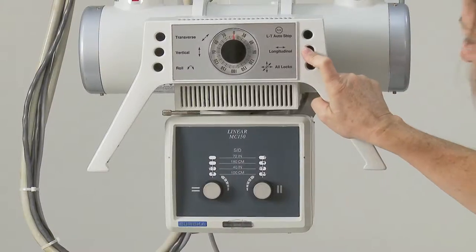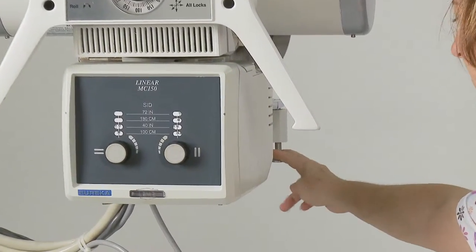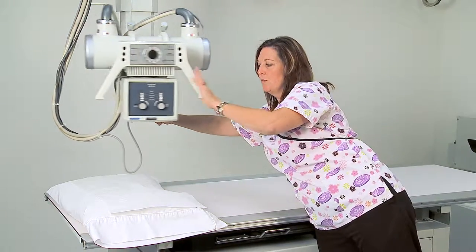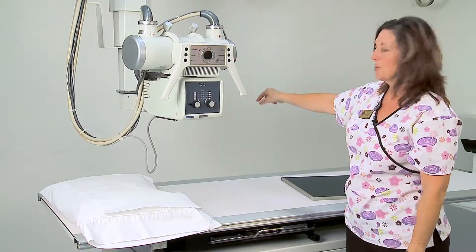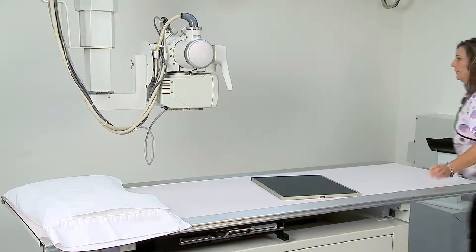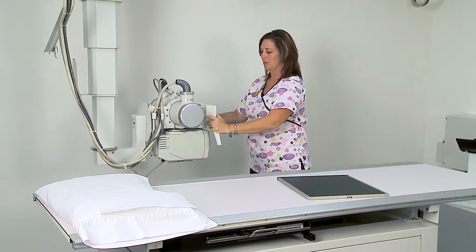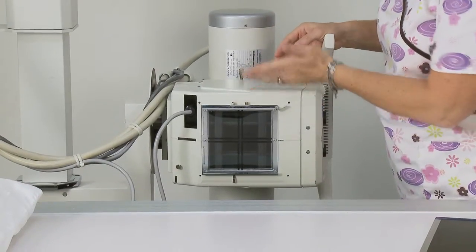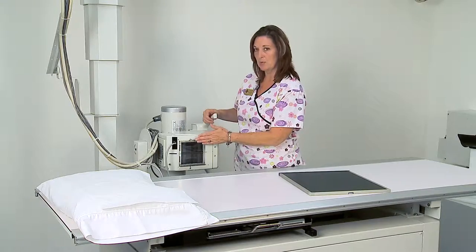At the end of the arm of the tube there is a pin secured into a circular area. If you pull the pin and depress it out, it will enable the tube to move back and forth around. We are going to turn the tube so it is positioned on the side of the table. By lowering the tube and hitting the roll button, we are able to make an exposure going across the patient's body — giving us a position from top to bottom and also from side to side.